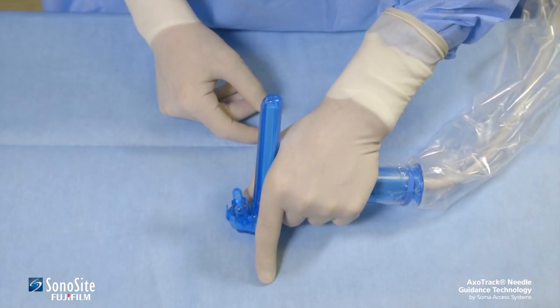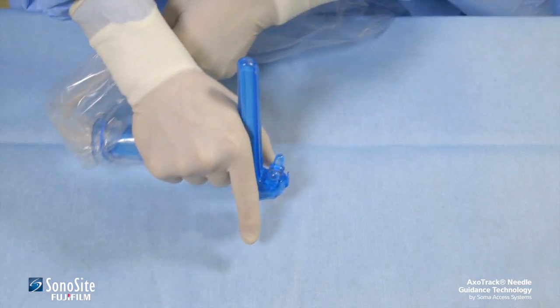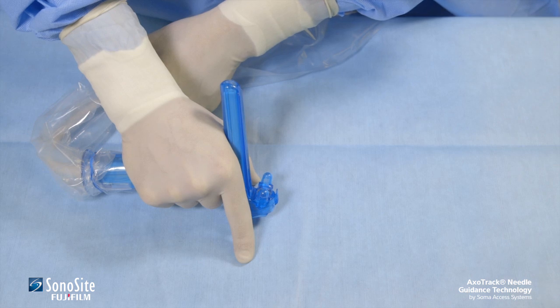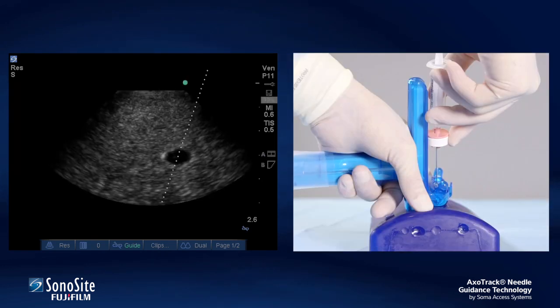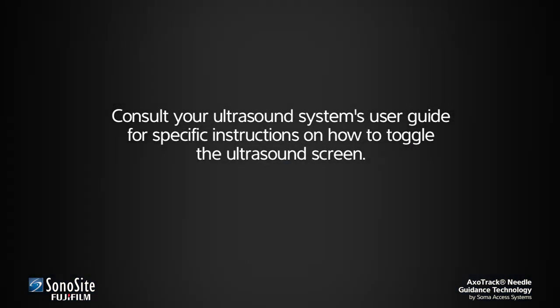Depending upon which hand is used to advance the needle during the procedure, it may be necessary to toggle the left-right orientation of the ultrasound image. If the needle is advanced with the left hand, the virtual needle should enter from the left side of the ultrasound image. If the needle is advanced from the right hand, the virtual needle should enter from the right side of the ultrasound image. Consult your ultrasound system's user guide for specific instructions on how to toggle the ultrasound screen.